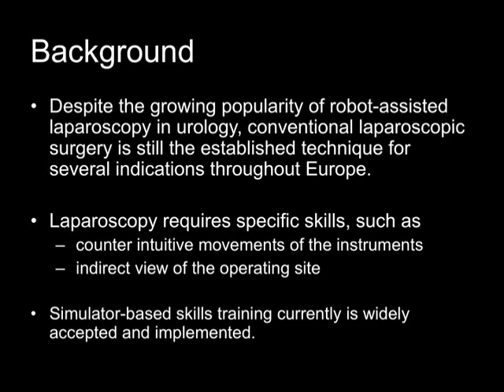Despite the growing popularity of robot-assisted laparoscopy in urology, conventional laparoscopic surgery is still the established technique for several indications throughout Europe. Laparoscopy requires specific skills, such as counter-intuitive movements of the instruments and indirect view of the operating site.